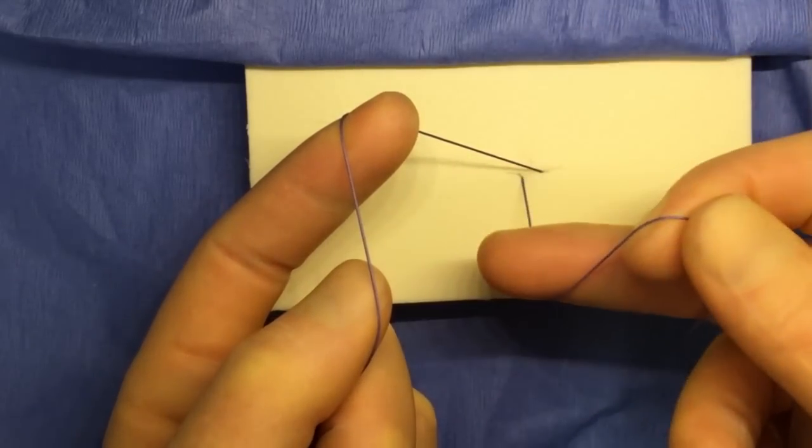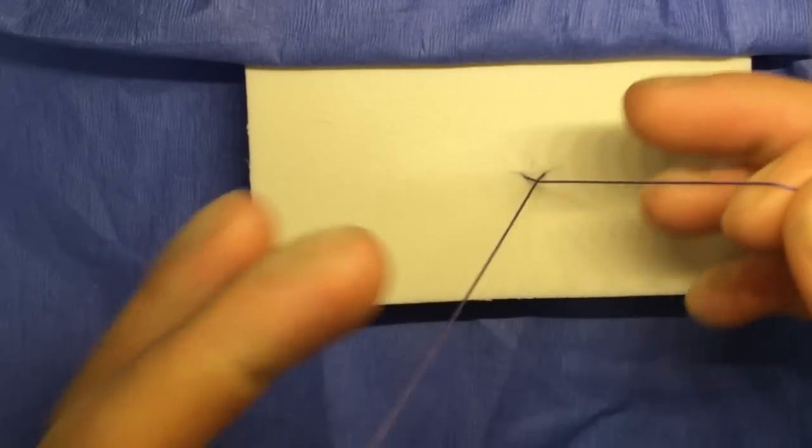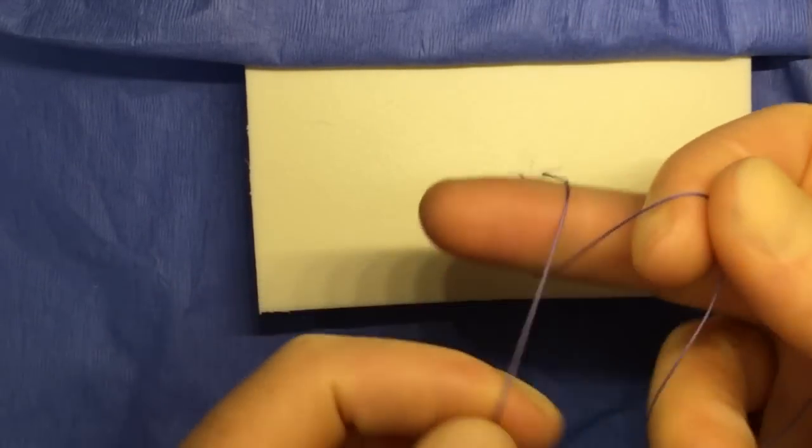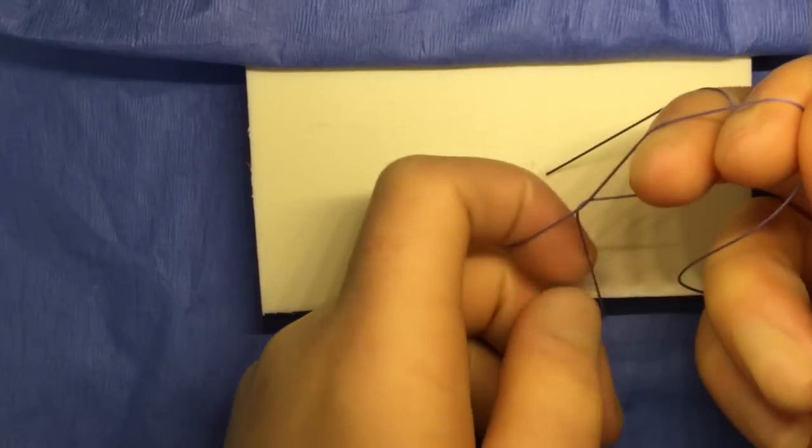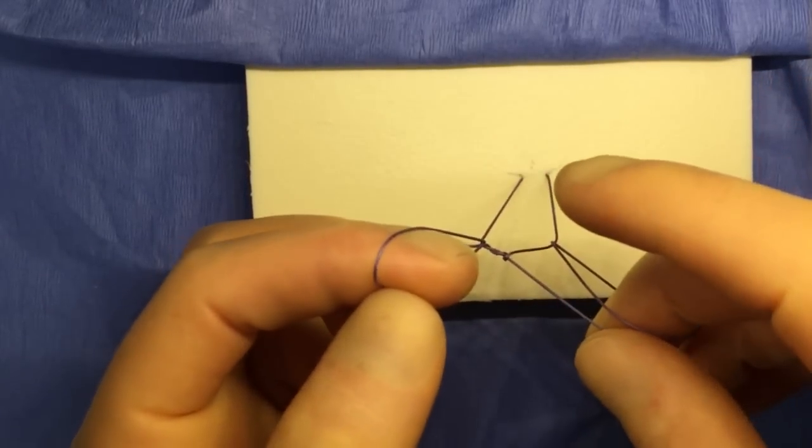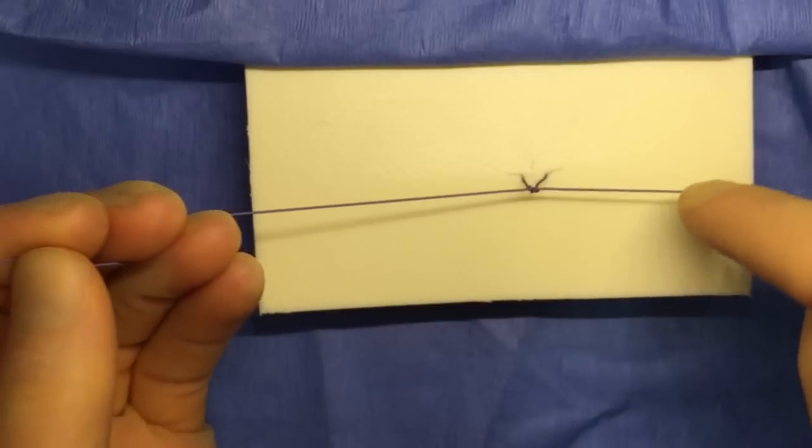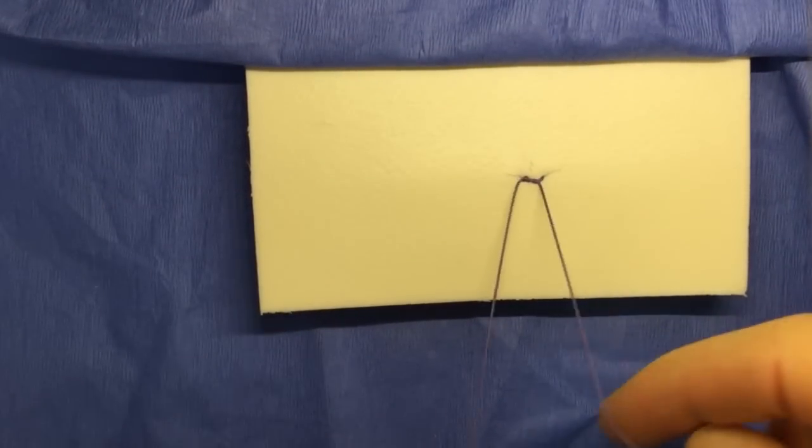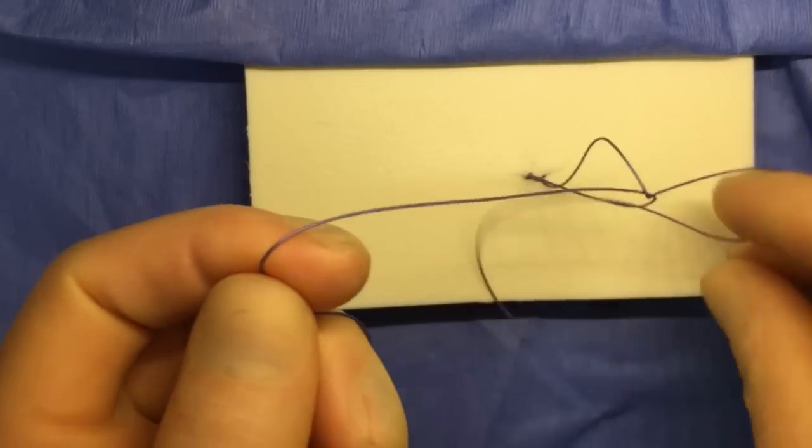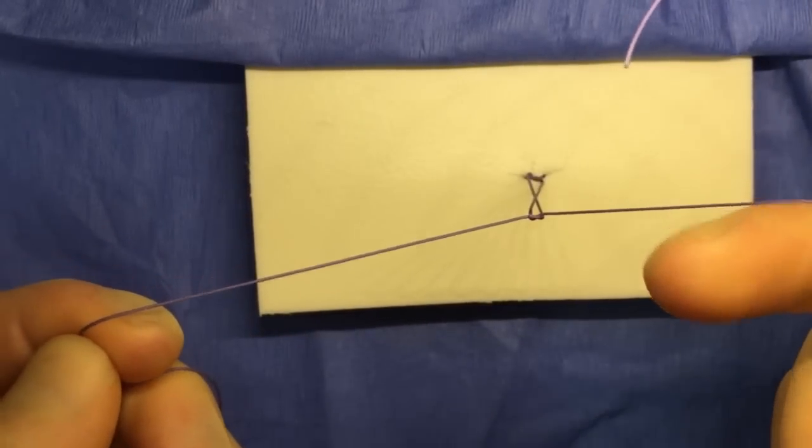Putting these together at the same time, again, pulling towards yourself with the right hand, pulling away from yourself with the left hand. A right-handed and a left-handed knot simultaneously, pulling away from yourself, and then that enables you to lay it down. Then you can finish the knot as you see fit.